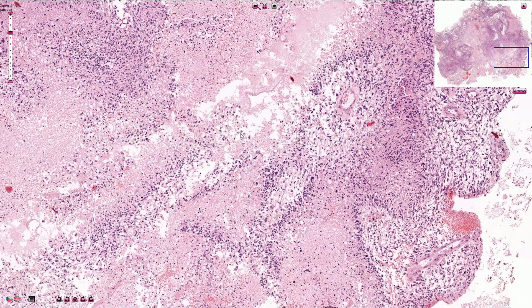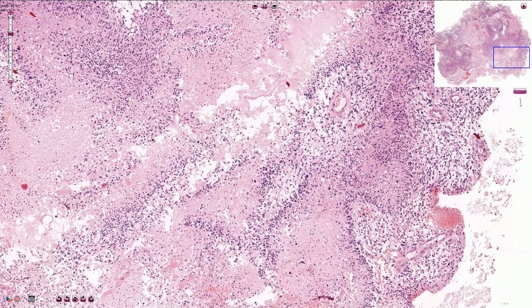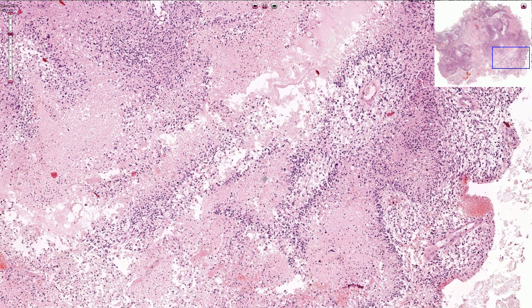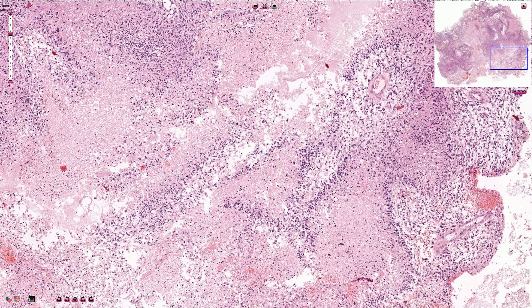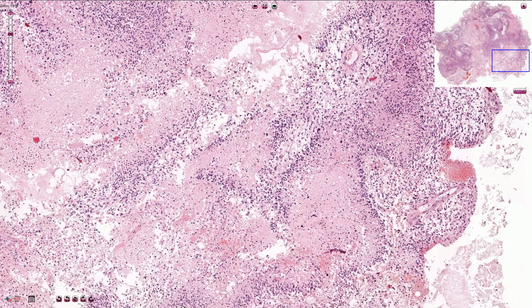So this is a necrotic glioblastoma with geographic, prominent necrotic areas and palisading of the atypical cells, with abundant apoptosis and mitotic figures.